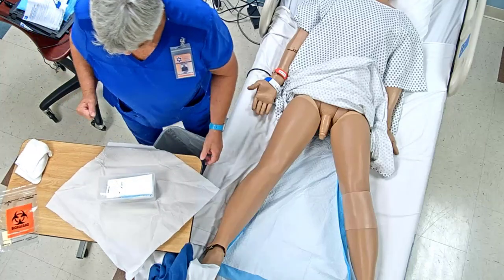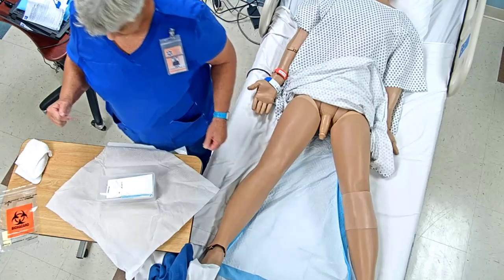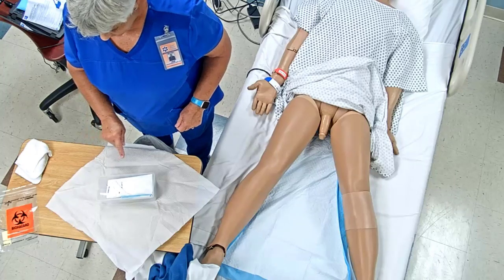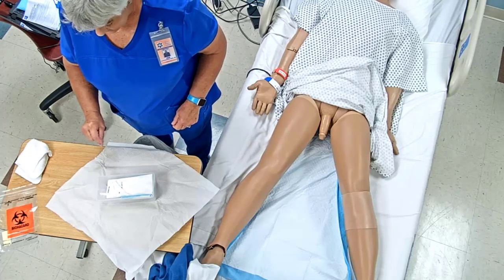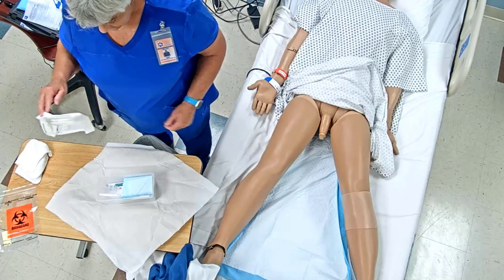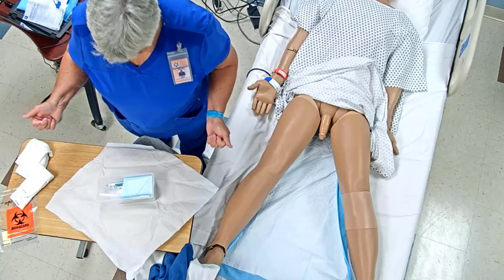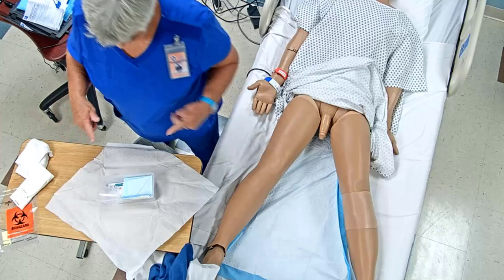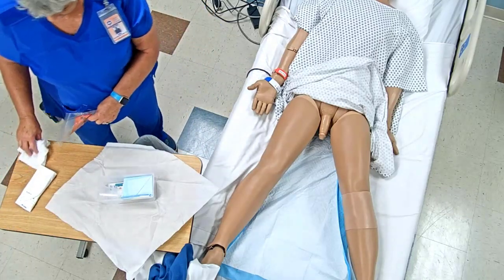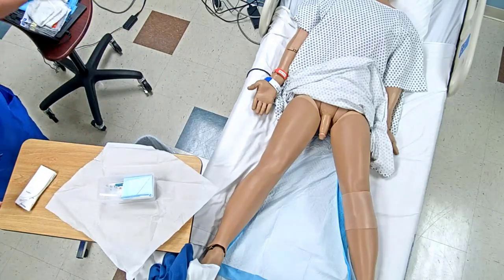Okay, so I'm just going to double check where I can reach in without reaching over. So if I reach in right here to get my gloves, then I know that I can't touch that part with my sterile gloves. So I'm going to go ahead and reach in and get my gloves. Okay? I'm going to put those off to the side. And since everything else is right there, I'm going to go ahead and get my gloves on. So I'm going to put that off over here to the side.